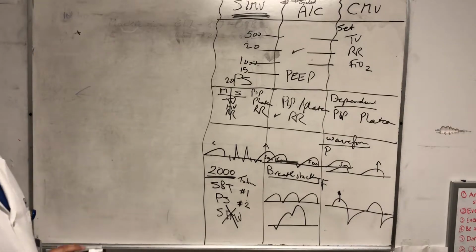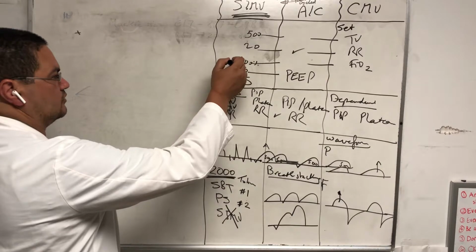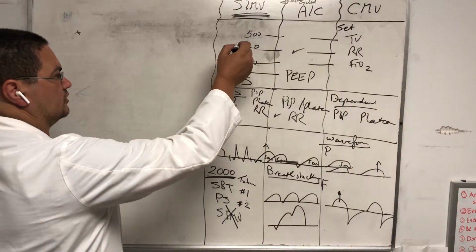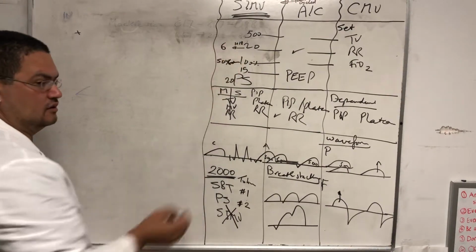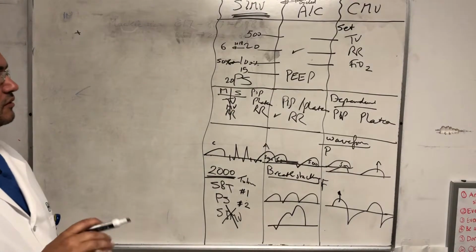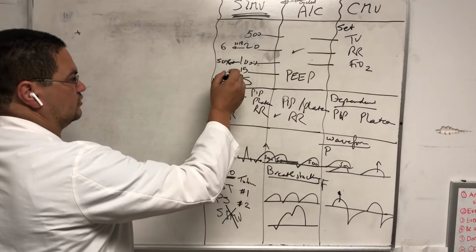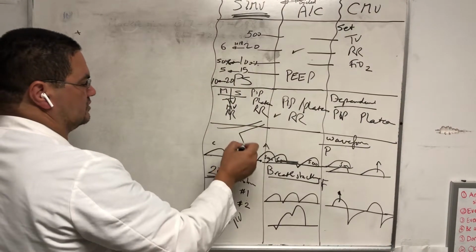Now you want to wean the patient. The first thing you wean is the FiO2, gradually, until you reach 50%, or actually at that time it was 40%. Then the next step is to go down on the respiratory rate gradually, literally 18, 16, and so on, every 6 hours, until you reach 6. Reaching 6 means you're giving only 6 breaths for the patient, and the rest is the patient's effort. Then you go down gradually on the pressure support until you reach 10. The last thing is to go down gradually on the PEEP until you reach 5. When you're at 10/5, you take the patient off the vent and put him on a T-piece.